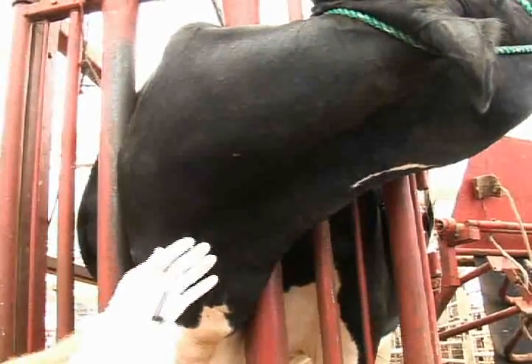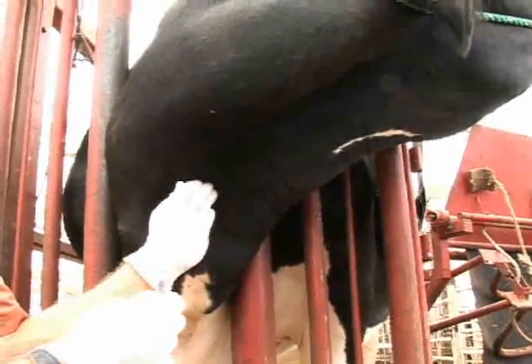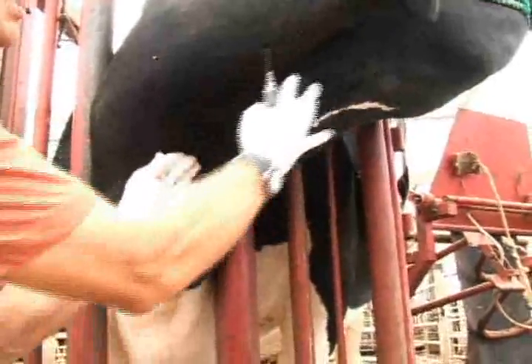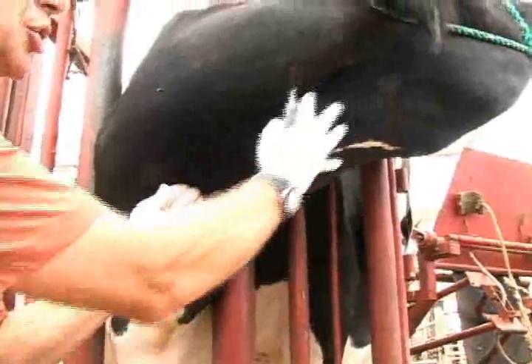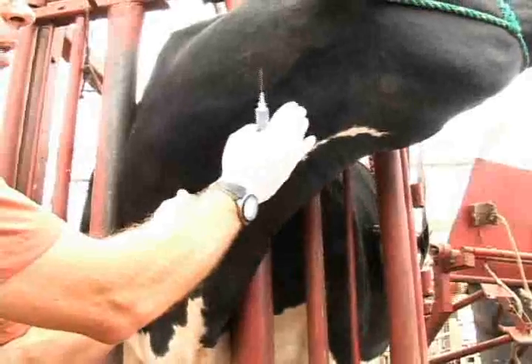What I like to do is use my four fingers and place them deep into the jugular furrow to allow for the jugular vein to distend. You can visually identify the jugular vein as it distends. Continual pressure will continue to allow distention of the jugular vein until it can actually be visually seen as well as palpated.